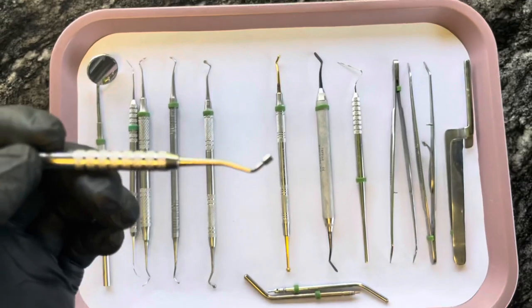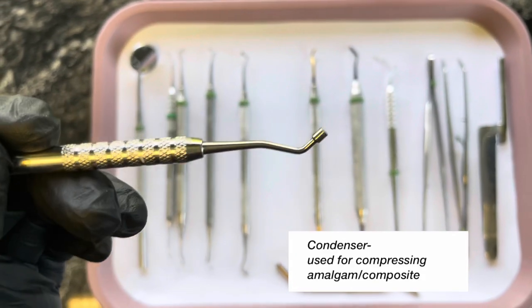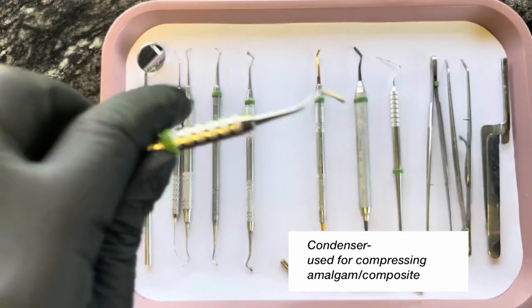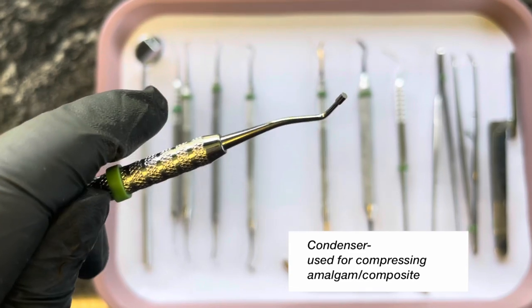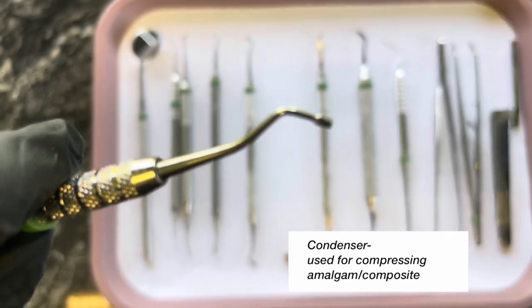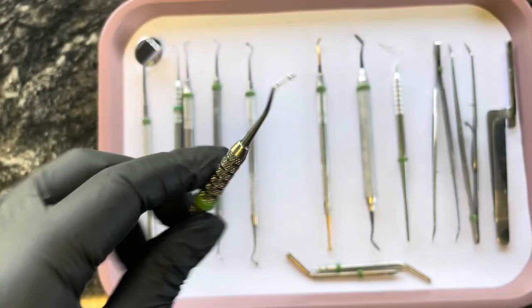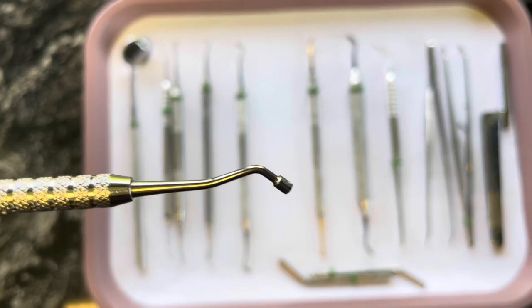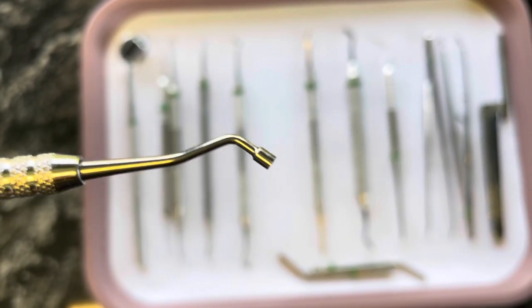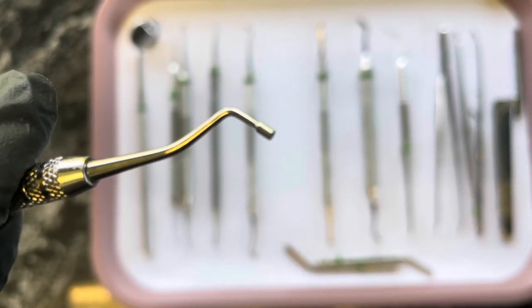This is a condenser. This is used to pack down composite. There's a bigger side and then the other side is smaller — one side is small, one side is big, depending on the size of your filling. And this is called a condenser.